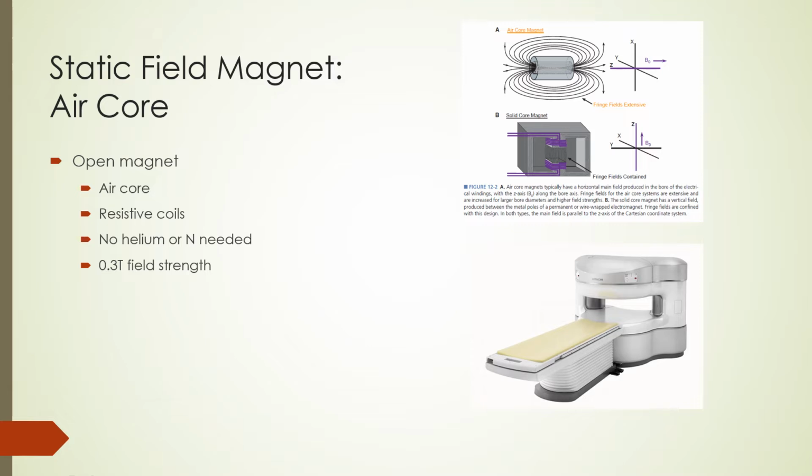The top image on the slide shows the coils in a resistive coil magnet. The bottom image shows a commercial magnet made from resistive coils.